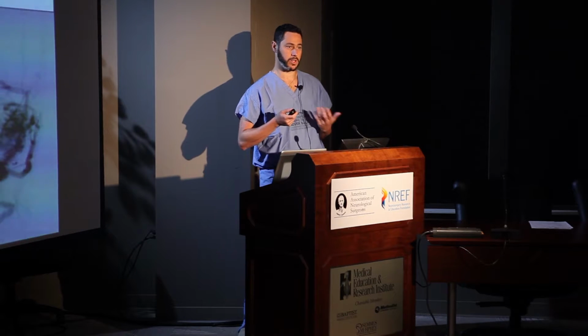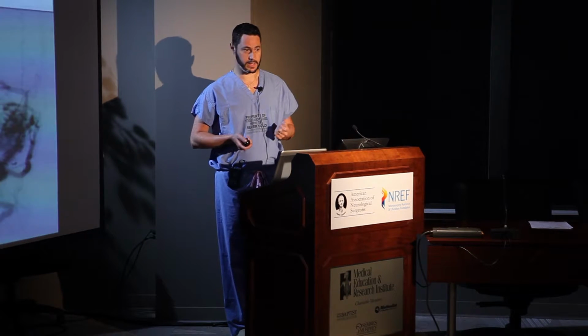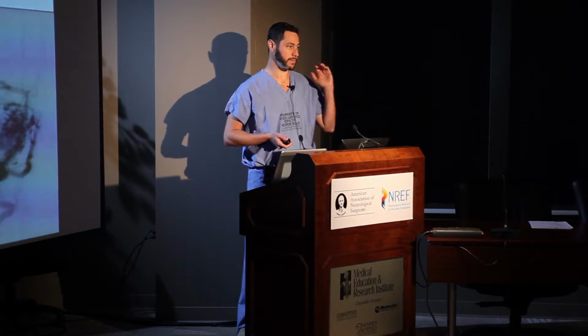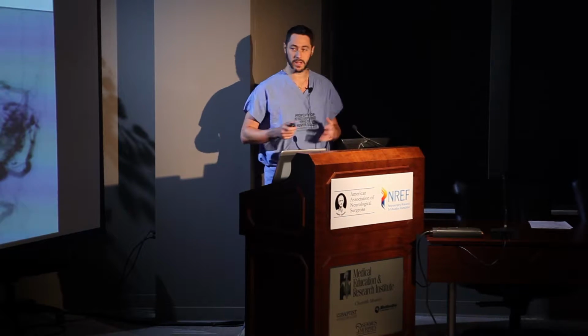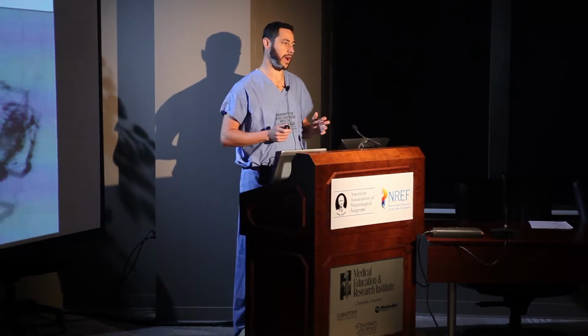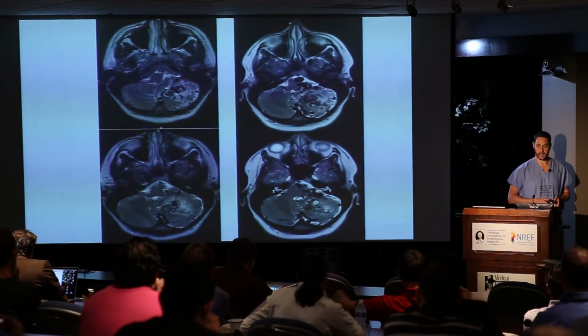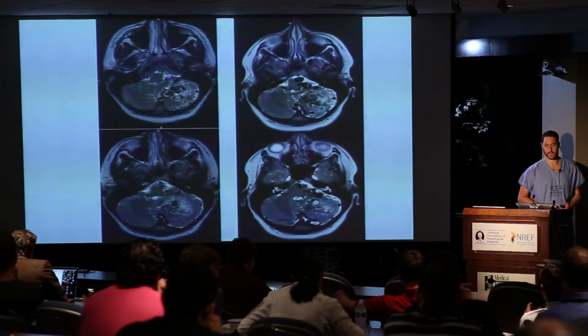I think when Joey was talking about Gerald Fischel, he said, we sit down, we look at the images. Tibor sends the patient home and sits down. These are complex problems. You can't just shoot a couple of pictures and now I have my plan. You really have to sit down and understand it all. And lots of times we learn a lot about what's going on with this patient not just by looking at the angiogram. The cross-sectional imaging is equally important.